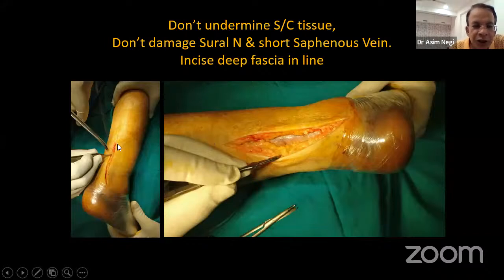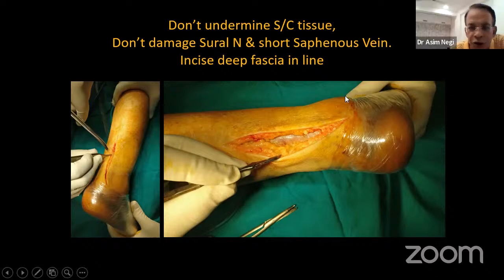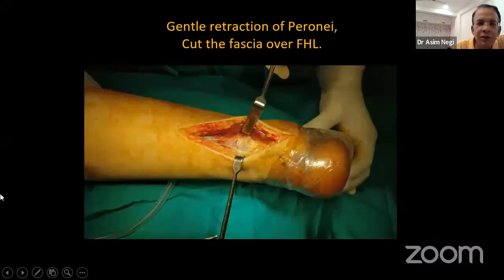While taking the skin incision, be careful. The sural nerve is not very deep. It may be just beneath the subcutaneous tissue. Don't damage the sural nerve. It's usually accompanied by the short saphenous vein in the distal part here. Incise the deep fascia and then gently retract your peroneals anteriorly.